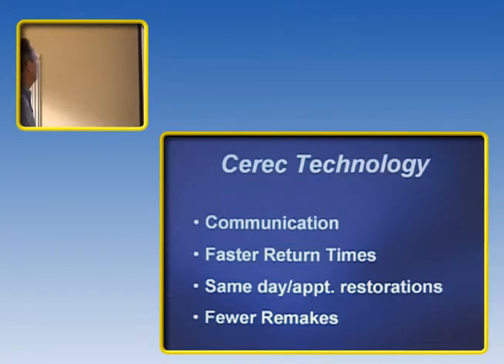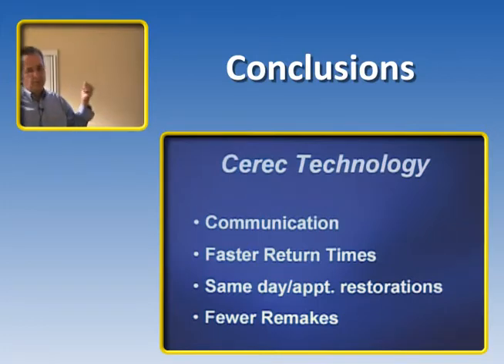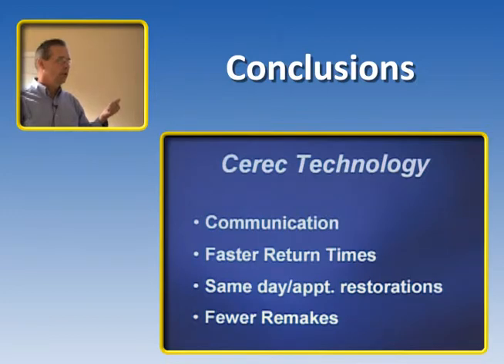Some of the things that we look at with CEREC technology, with CEREC Connect, using it as a communication tool. It's certainly very easy that if you tell me, hey, I've got a difficult patient coming in, I'm going to prep it at this time, can I upload the case and review it? You can end up talking together in real time about it. I could end up doing a design and check it out too, just to make sure that it is going to work in the lab.